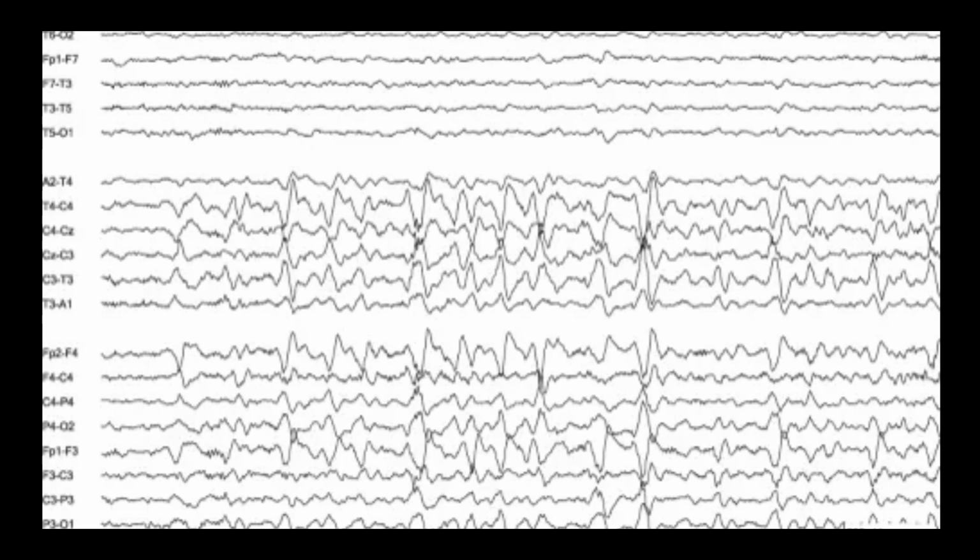Now we've got delta waves. Are there other sleep rhythms too? Oh yeah, there's a whole bunch of them, like sleep spindles, vertex sharp waves, and those sawtooth waves during REM sleep, the dreaming. All playing these unique roles in our sleep cycle. So it's not just delta, it's all these different things. It's a whole symphony of activity happening during sleep. A symphony, I like that.